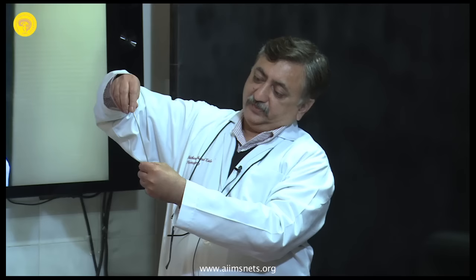You expose the whole thing, you see the transverse process, and the transverse processes in the thoracic spine go upwards like this. Go up. So you dissect all this soft tissue away till you see this. Again, the line in the middle of the transverse process. But here, the only difference is it's not the middle, it's in the upper part of the transverse process. So your horizontal line, instead of in the middle of the transverse process, will be at the upper end of the transverse process. That's your horizontal line.